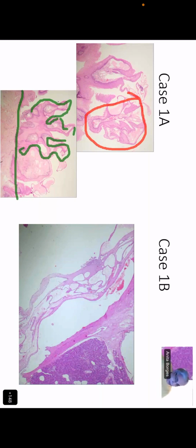Anybody else? Come on now, one by one. That was Diya. So, Limpy, do you think Diya is right when she called this a papilla? You just have to answer yes or no. Limpy, are you there? If you don't answer immediately, I don't know whether you are there or not. Hello, ma'am. Yes, ma'am. Niveta. A papilla should have a fibrovascular core in the center.